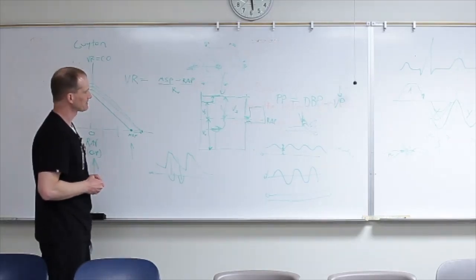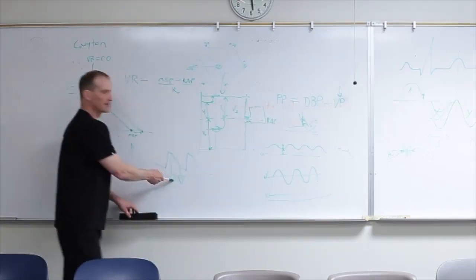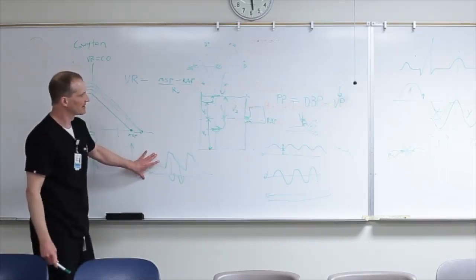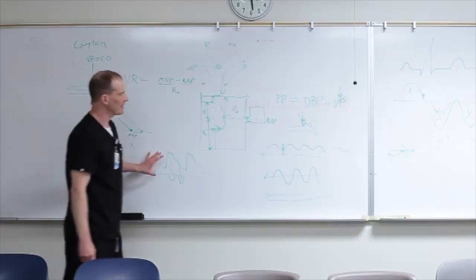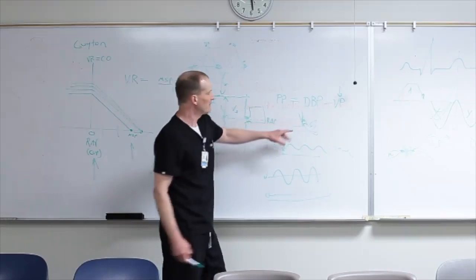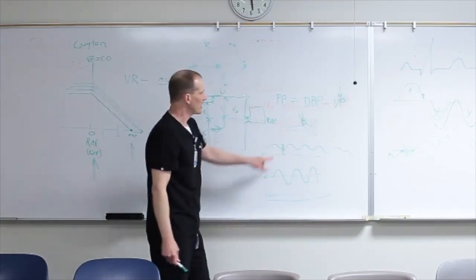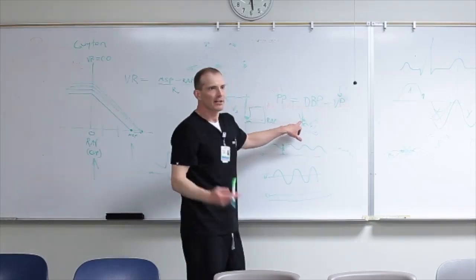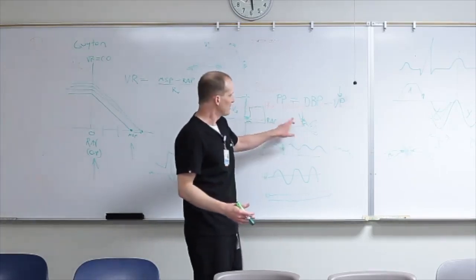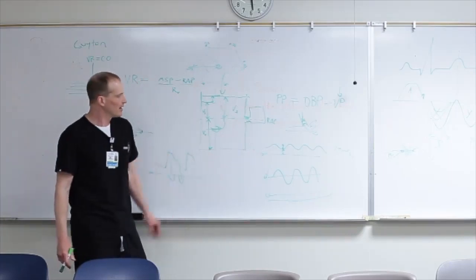All right. So I think this is really hard to do, so you have to practice a lot. So we're going to leave that alone. And I think the hepatic vein we can probably leave alone too, because if you put the color box over it, that's probably good enough. To put the pulse wave Doppler on it, unless you're really good, the patient's moving, they're breathing, things are moving around, and it might be hard to get a hepatic vein Doppler waveform.